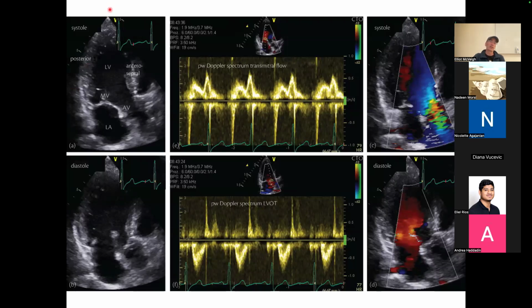If our transducer is on up here, right? And so this is the left ventricle of the heart. You can see this kind of half of a football shape like this, or half a rugby ball, depends where you come from. And the transducer for this shot is not usually going through the ribs. It's usually positioned further down to the bottom of the rib cage, and you try and tuck it under and look up under the ribs so that you're looking at the apex of the heart. And you'll get this view.